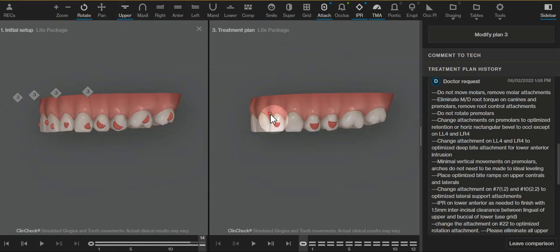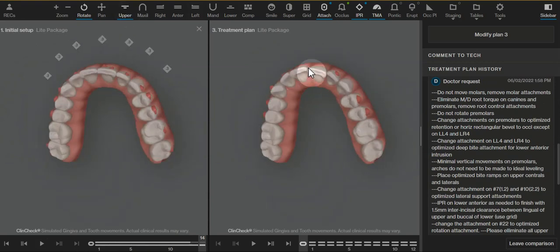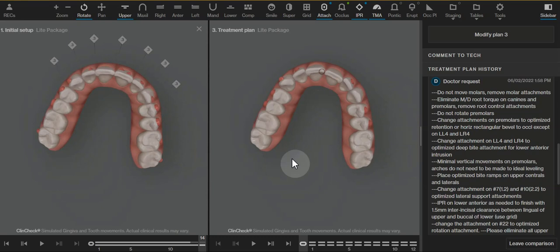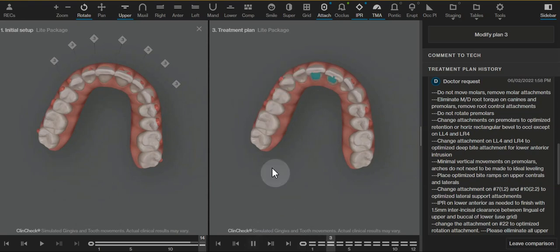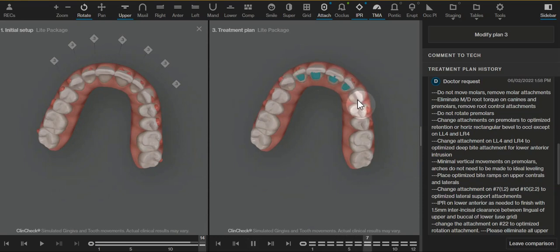That'll help correct and get the aligner well engaged with the entire arch, so that way these rotation movements with the canines and just some buckle movements of the anterior is much more predictable.